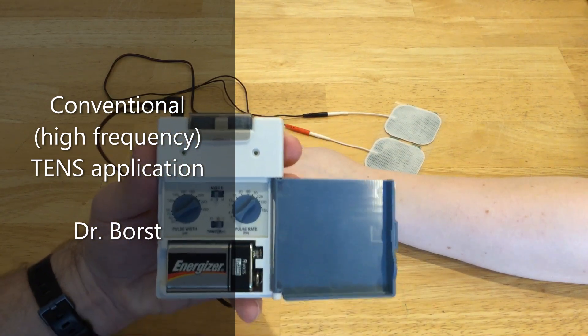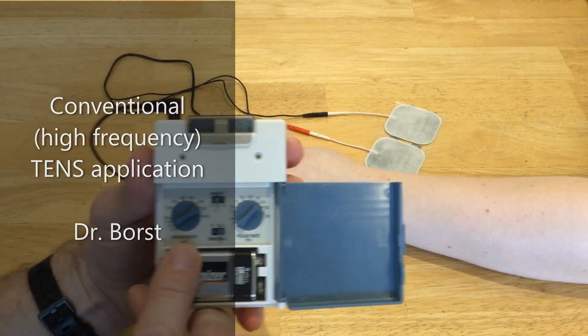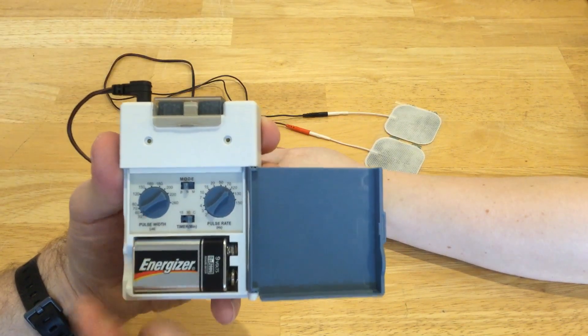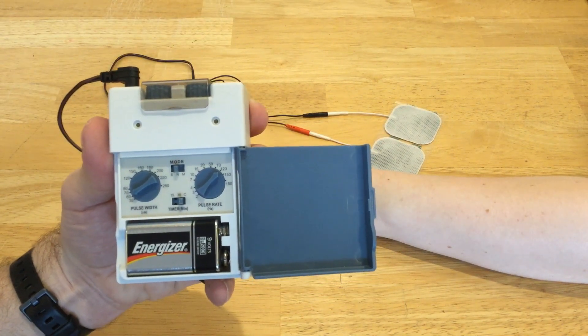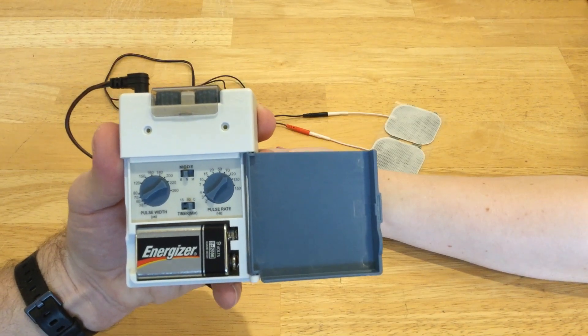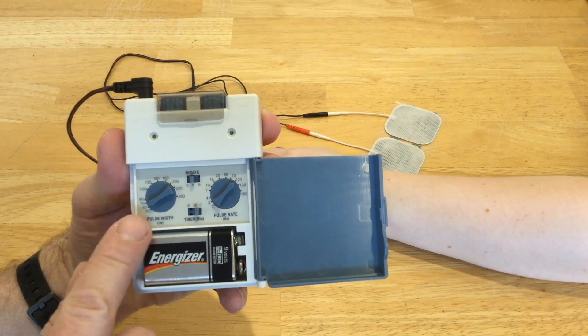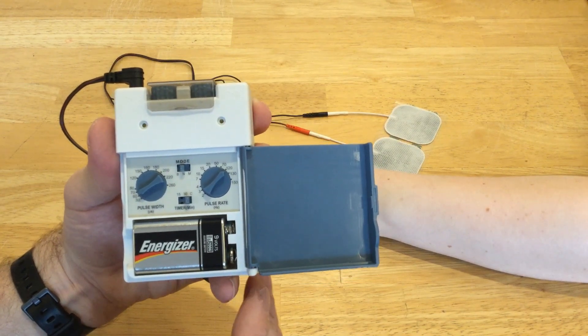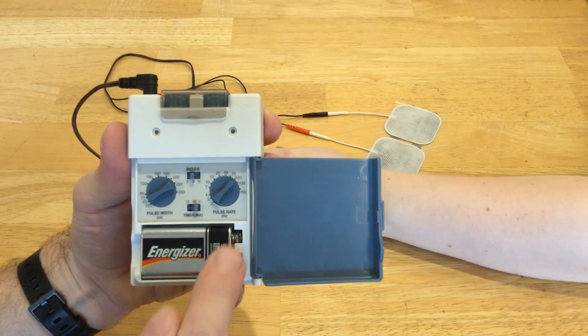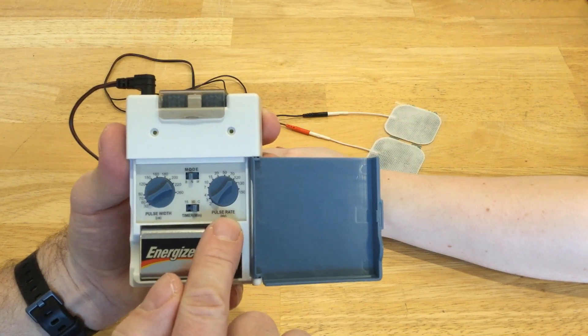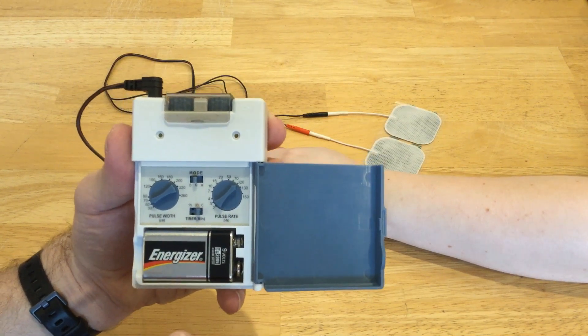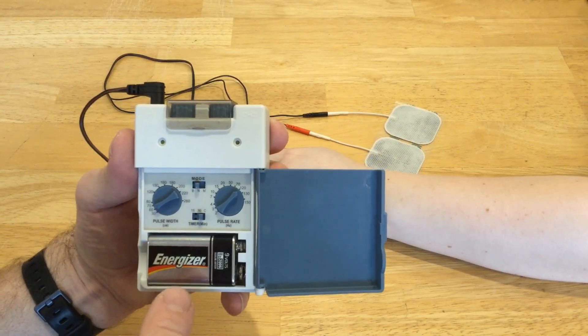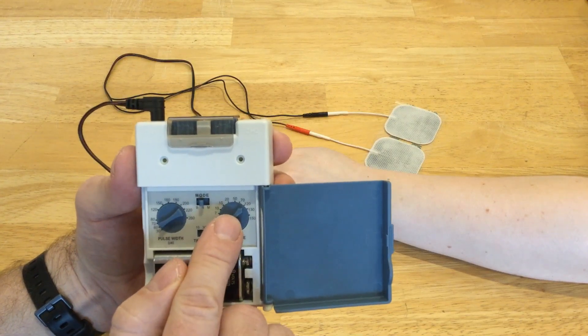For conventional TENS, you want your pulse width or pulse duration set between 50 and 80 microseconds. You can see here I have it at 60 microseconds. And you want your pulse frequency or pulse rate set between 100 and 150 hertz or pulses per second. You can see here I have it set at 120.